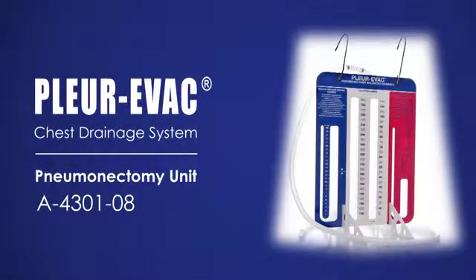The Plurivac Pneumonectomy Balanced Drainage Unit is a sterile, single-use device intended for post-operative care. It consists of three interconnected chambers: collection, negative pressure indicator, and positive pressure control. The unit is not to be connected to suction, nor are its contents to be re-infused.